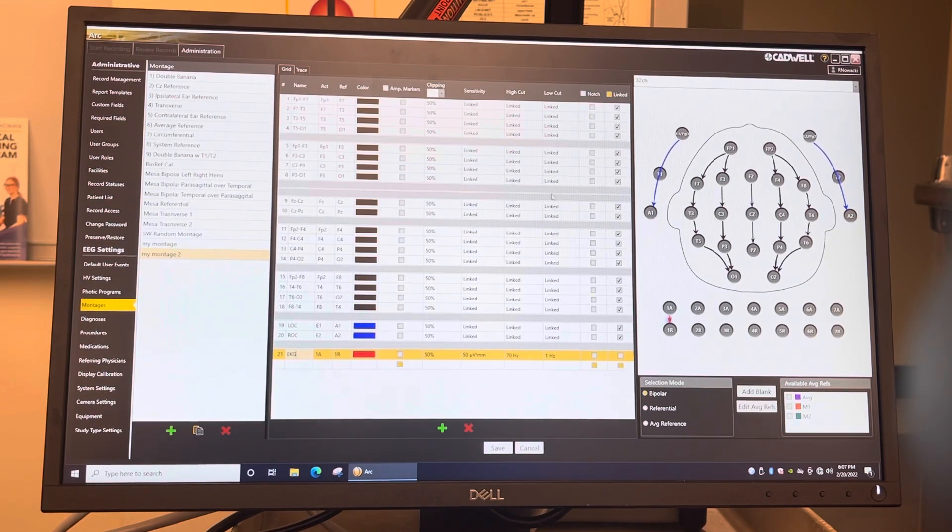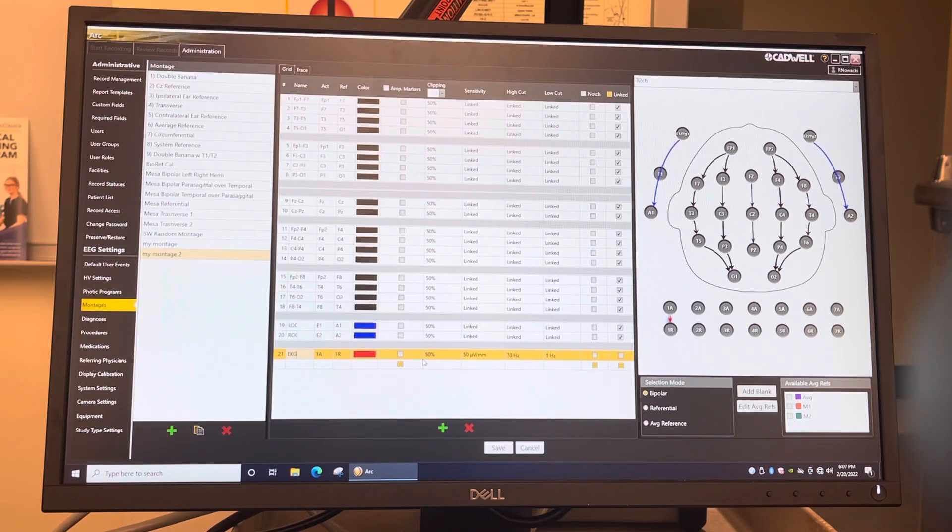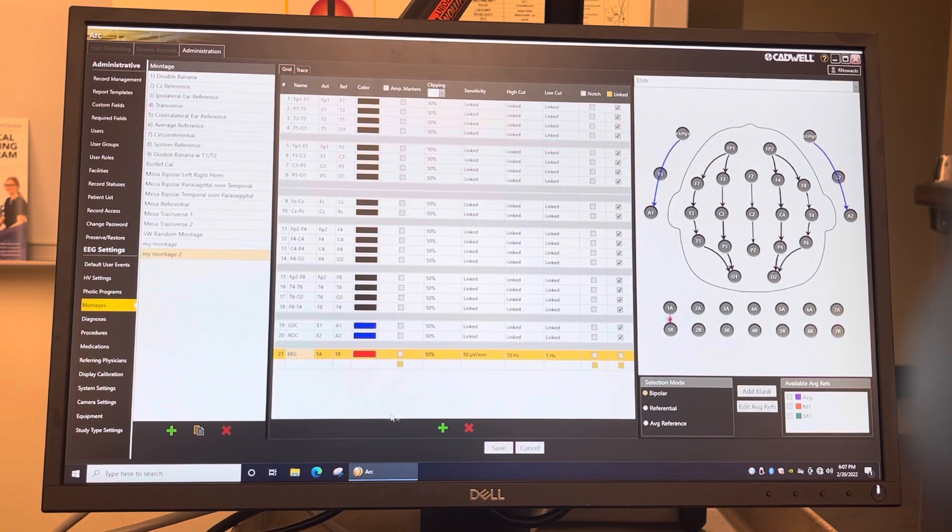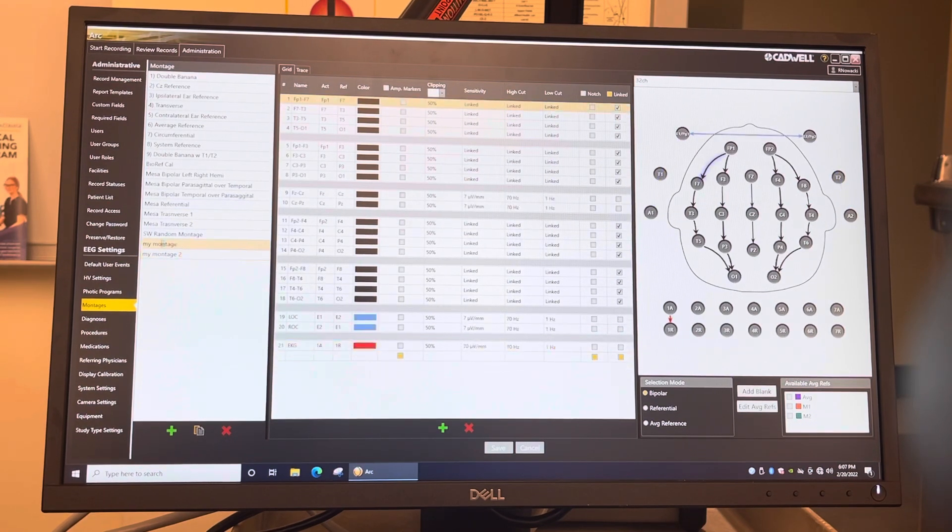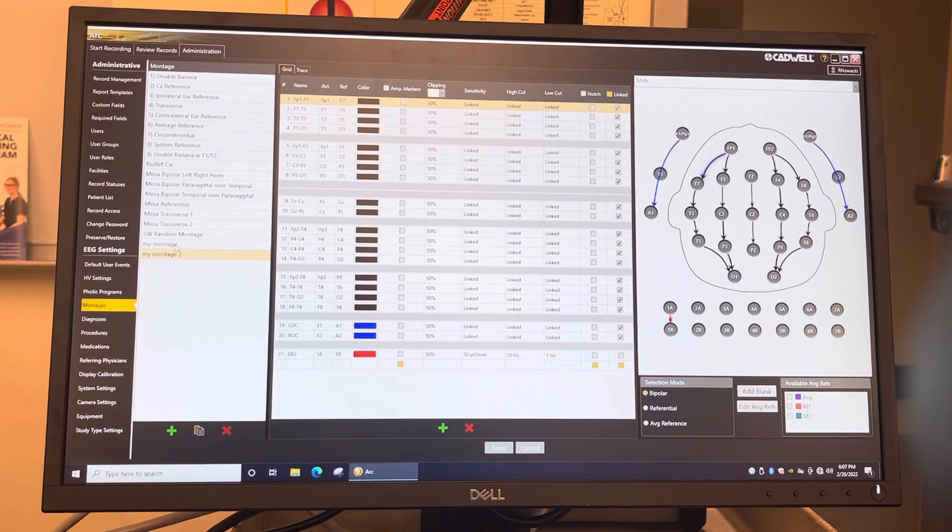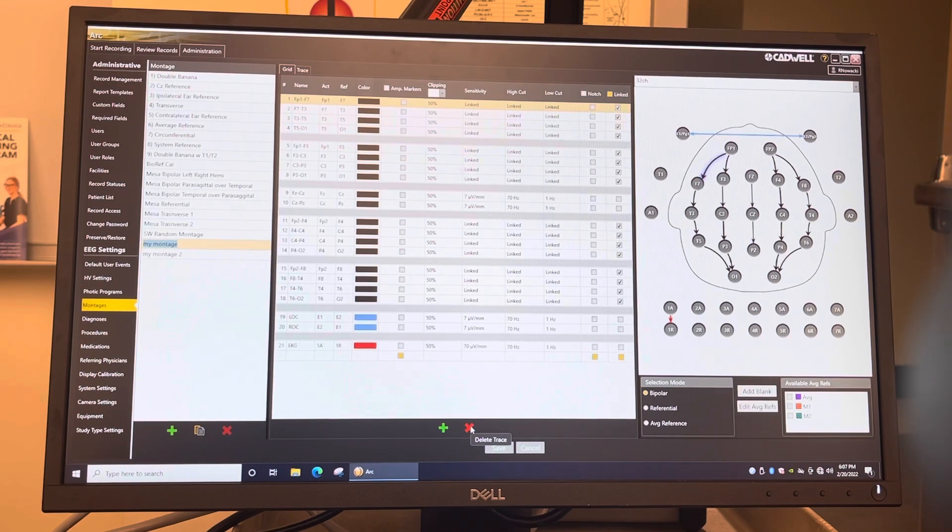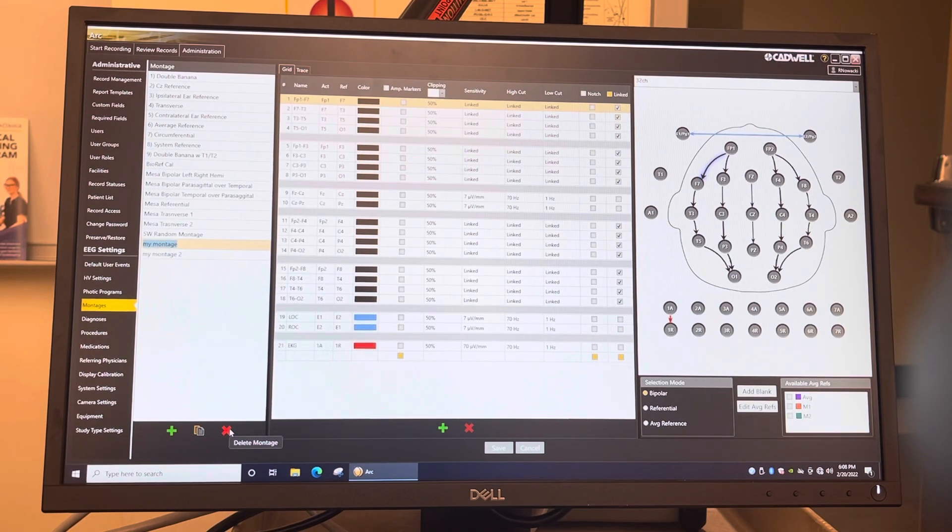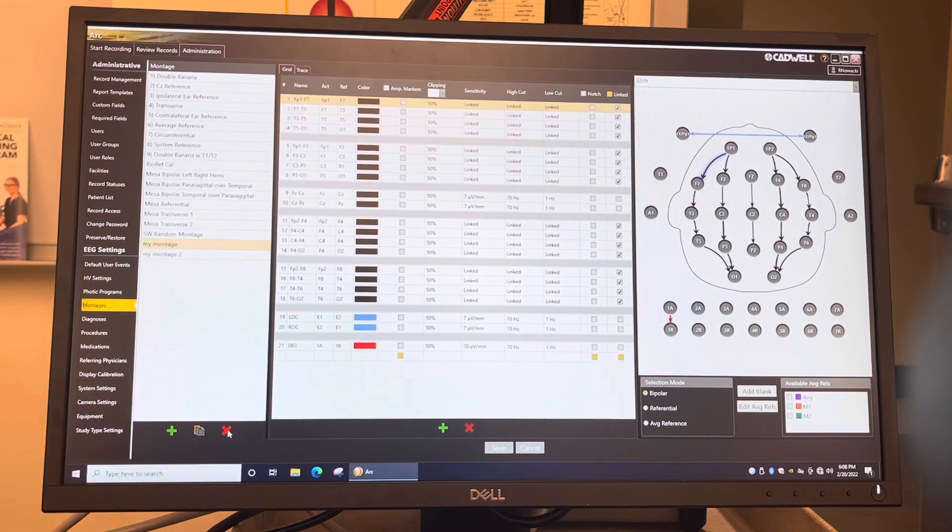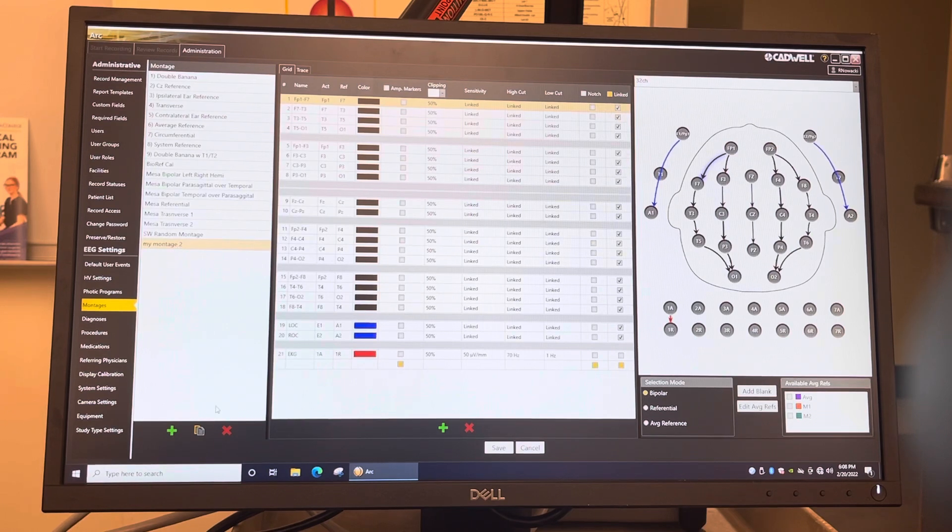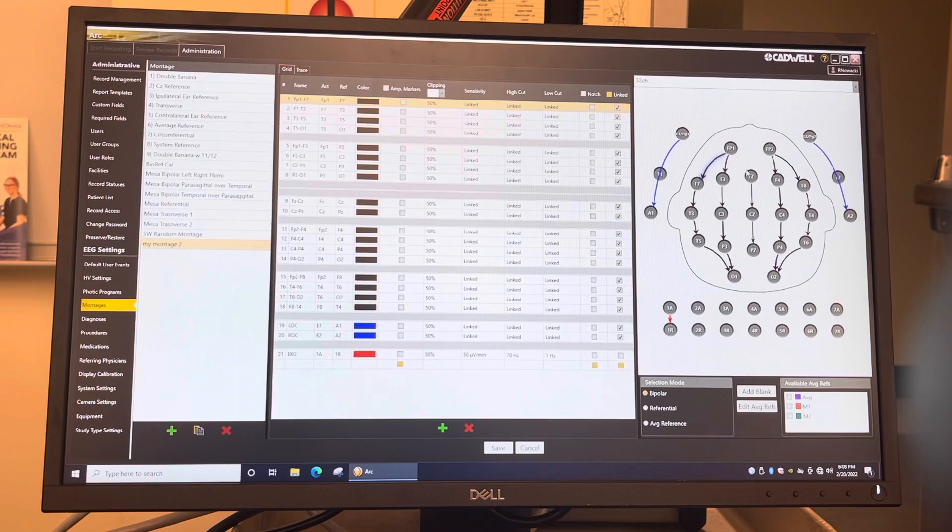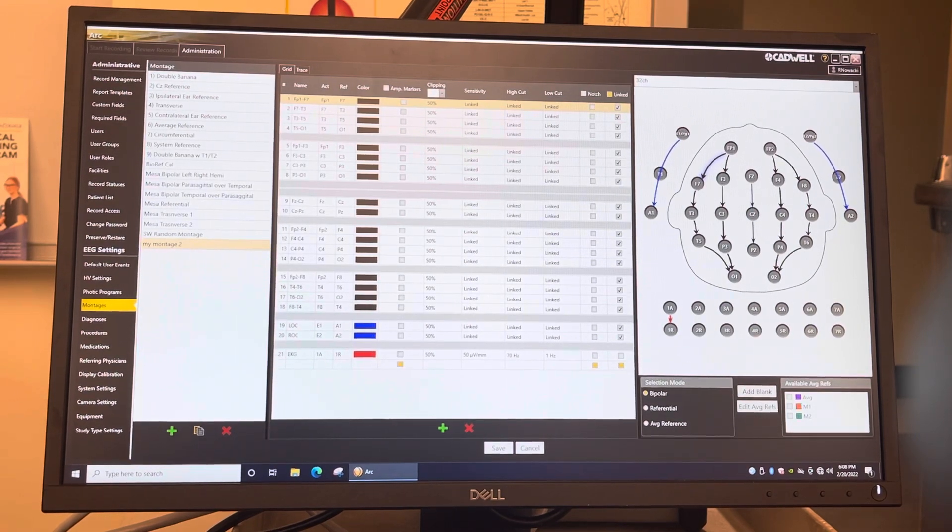And that's really all there is to it. I think Cadwell is really the easiest to program. And then after you're done programming it, you just hit save. And there it is. So there's your montage. To delete your montage, you just click on it and then you hit down here and you click delete montage right here, and it'll go away. And yeah, so there you go. And then, bye bye.